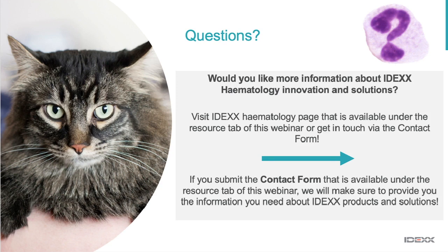So if you do have a reticulocytosis with or without the anemia, that warrants further evaluation, because if there is an anemia, it puts it into that proper category of regenerative anemia, which now gives further diagnostic direction to find the cause. If you get the reticulocytosis without anemia, at that point, now you have to start digging for underlying disease that might be quite occult in nature.